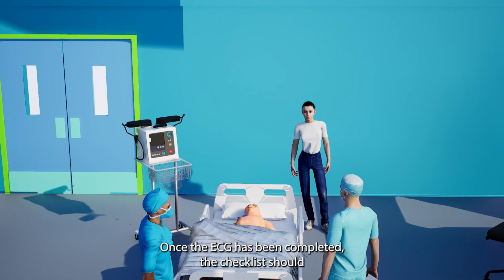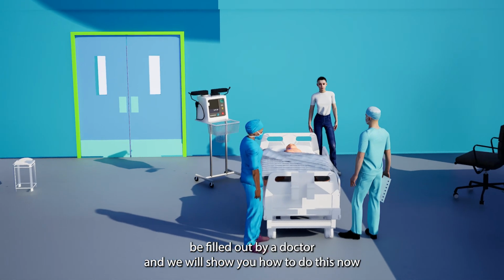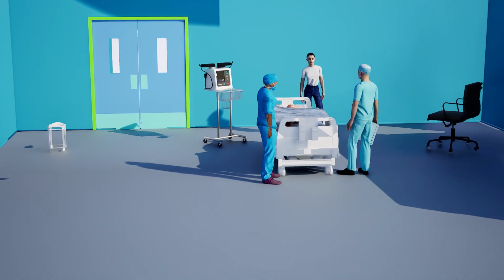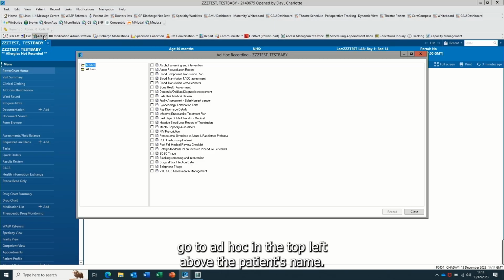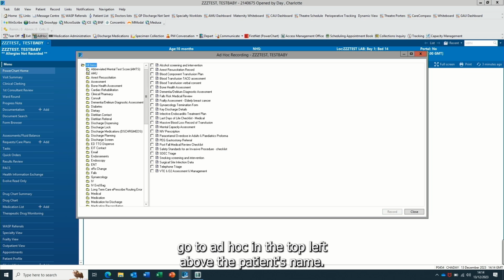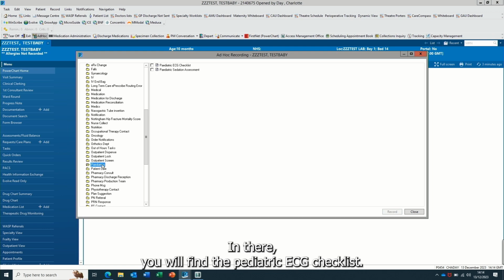Once the ECG has been completed, the checklist should be filled out by a doctor, and we will show you how to do this now. To find the ECG checklist, once on your patient's records, go to Ad hoc in the top left above the patient's name. Click on All Items and scroll down to the folder named Pediatrics. In there you will find the Paediatric ECG Checklist.